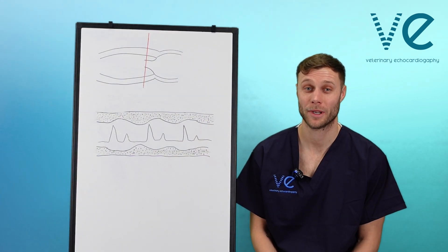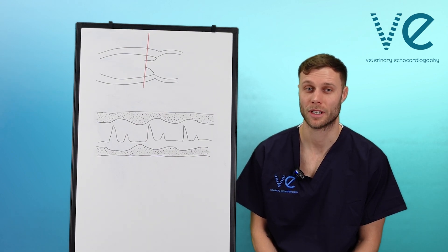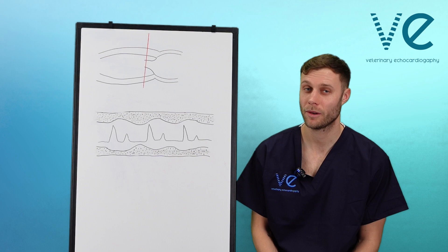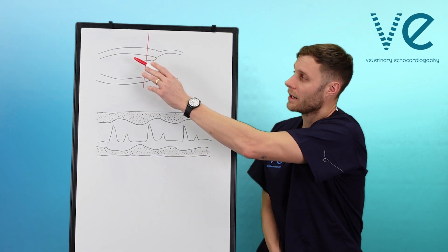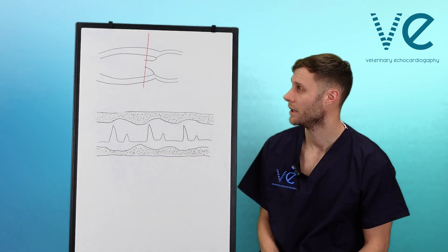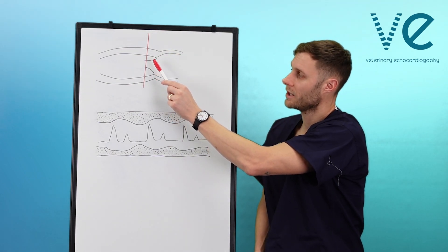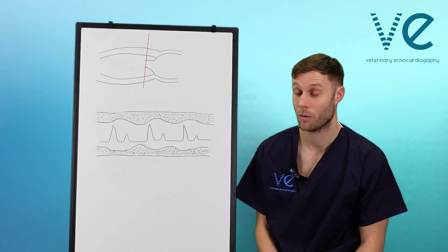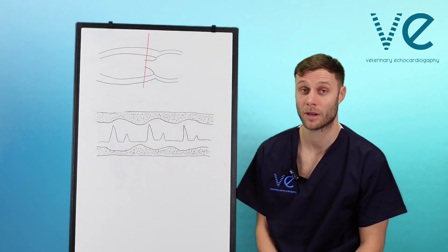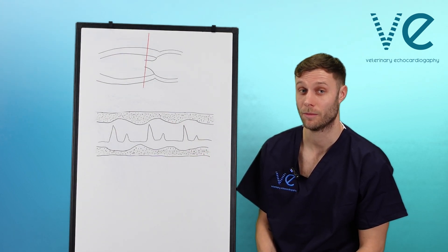In this video, we are going to look at E-point to septal separation. This is a great useful tool to measure function of the left ventricle, and all you have to do is gain a parasternal long axis — or you can do this in the short axis as well. When you gain your parasternal long axis, you place an M-mode cursor through the tips of the mitral valve leaflets. We're going to do a live demonstration, but first I just wanted to walk through the trace you should expect to get when you put the M-mode through.